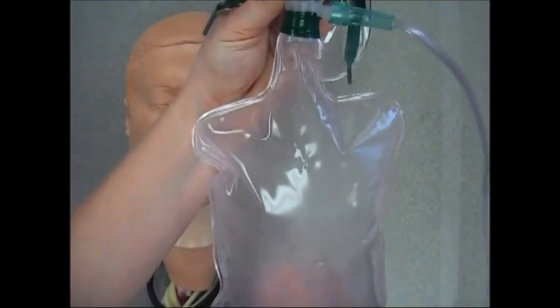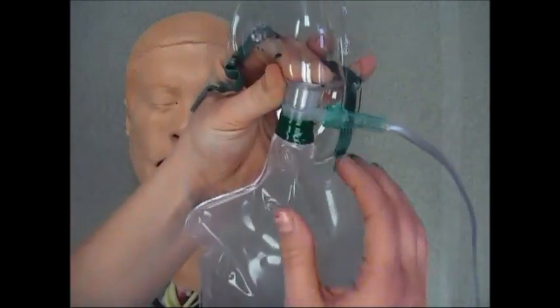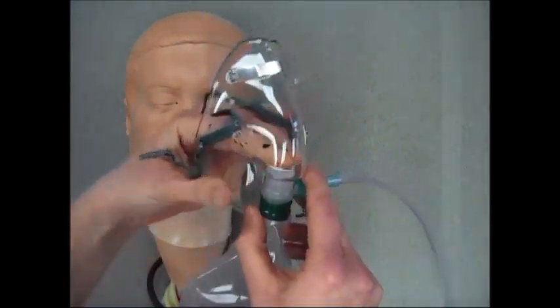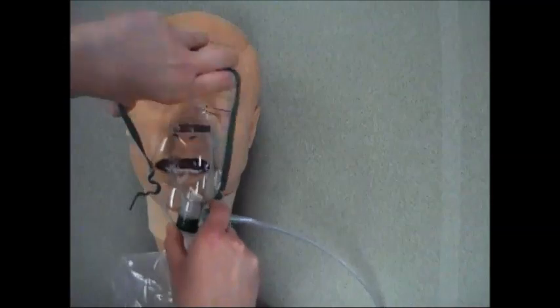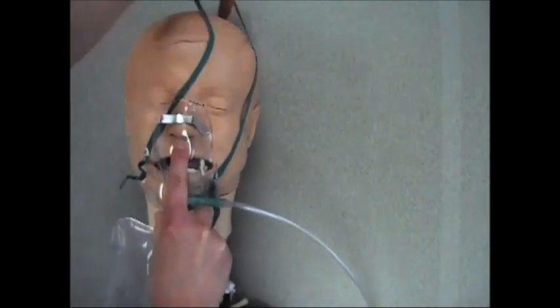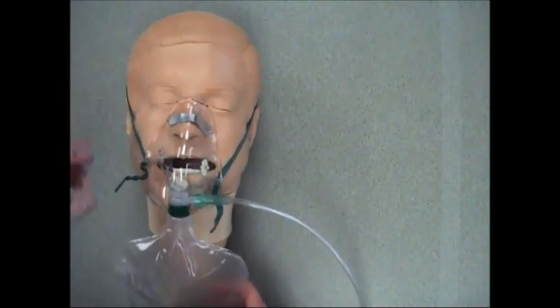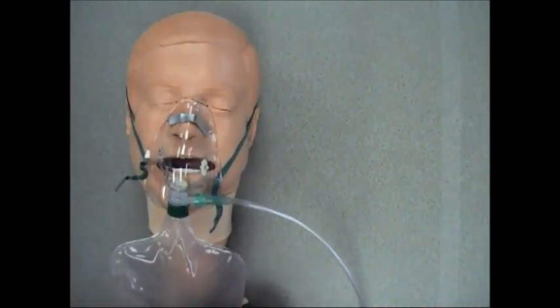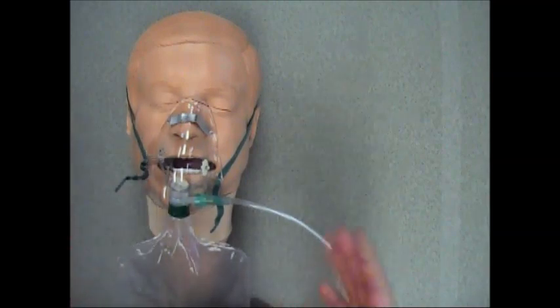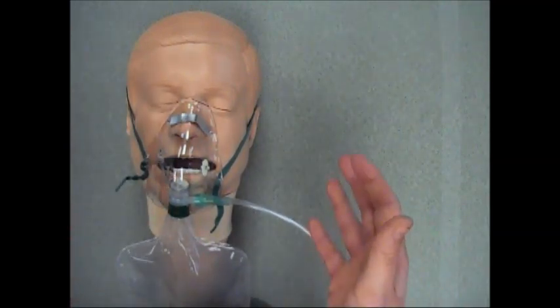When you're ready, apply the mask to the patient and allow that patient to breathe in from that reservoir bag. The non-rebreather mask is intended for moderate to severe respiratory distress.